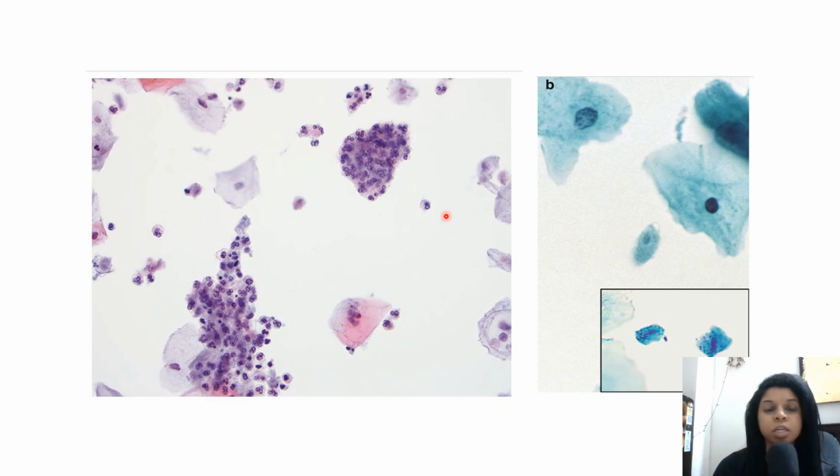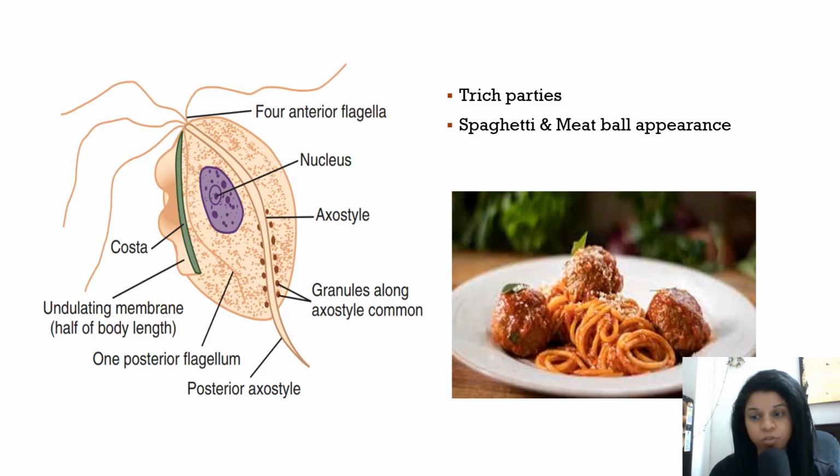But what I check is that if there is a history of vaginal discharge, and then you can see these polyballs, marked inflammation, and the granular background, which is suggestive of discharge again, and then you check for the trichomonas in the smear, then you will get it. But some people, even without being told all these things, easily catch trichomonas also. So all the things that catch your eyes are different.